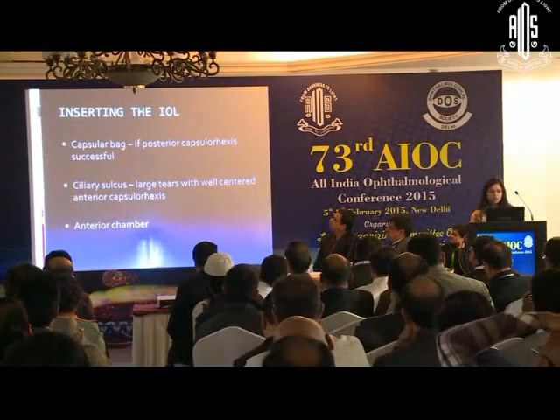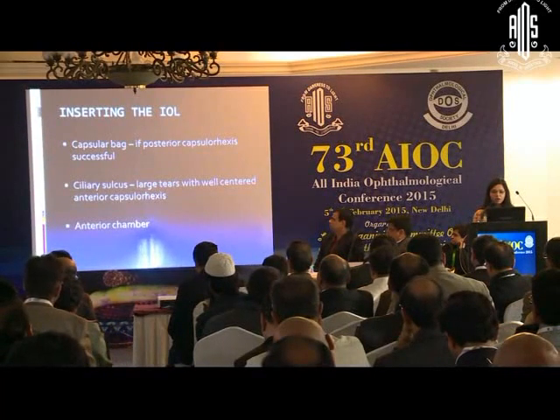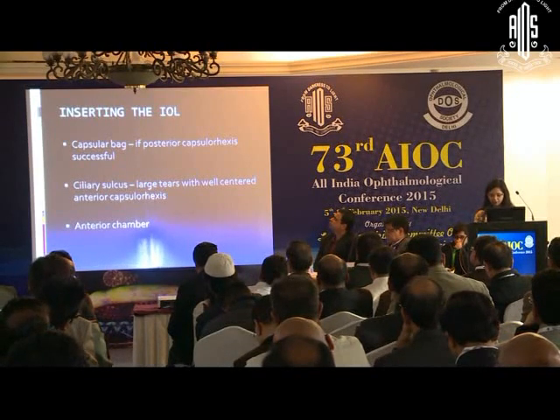Again, this I just told you, for a ciliary sulcus placement, if there is a large tear and a well-centered anterior capsulorhexis, you can use a sulcus. Otherwise, an anterior chamber IOL can be considered.